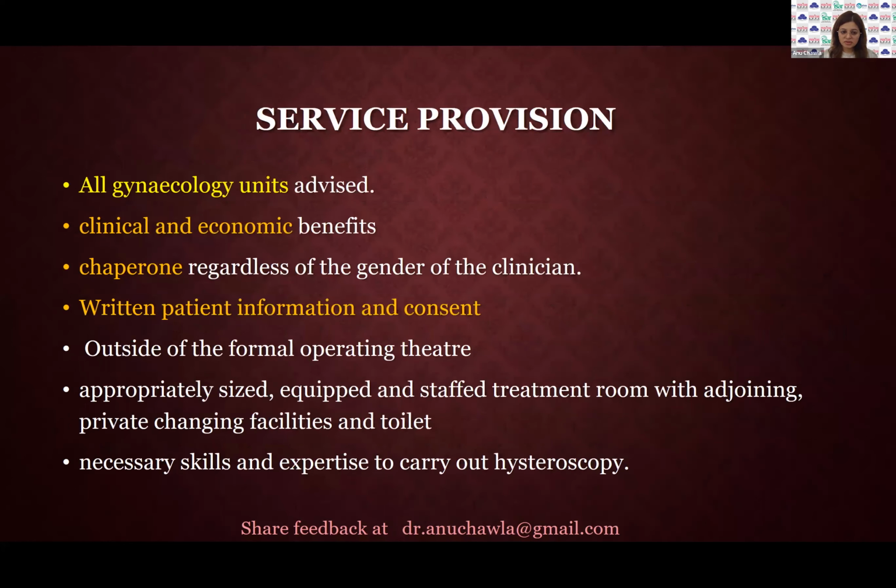The service provision is as given in the slide. All units are advised to have it because there are obvious and clear clinical and economic benefits to the patient and to the whole healthcare system. For example, especially in the bigger hospitals, we are not making an oncology patient wait while polypectomies pile up, because these are simple procedures and 60% of them can be done in the office rather than the OR, especially when we're talking of fertility couples.